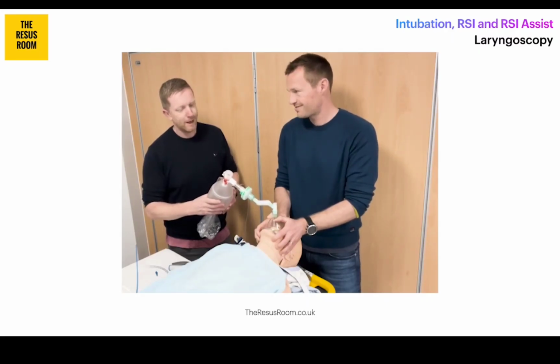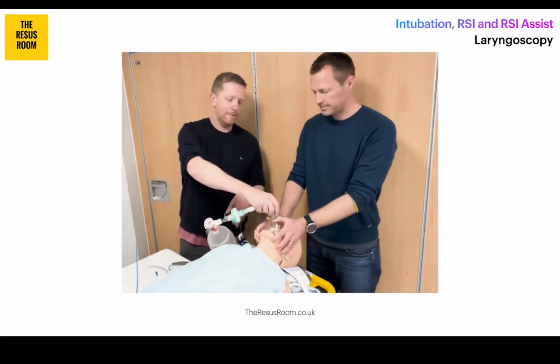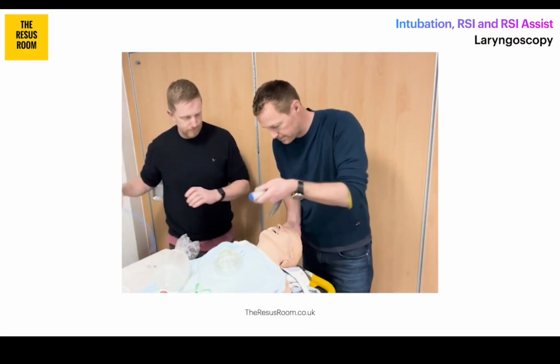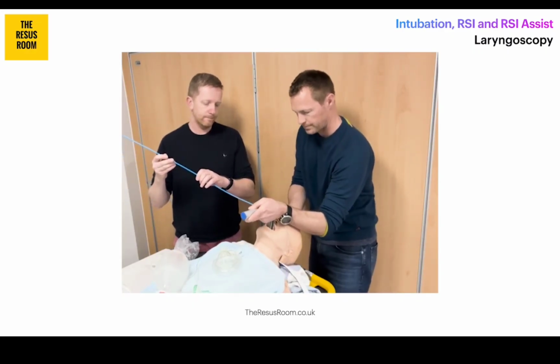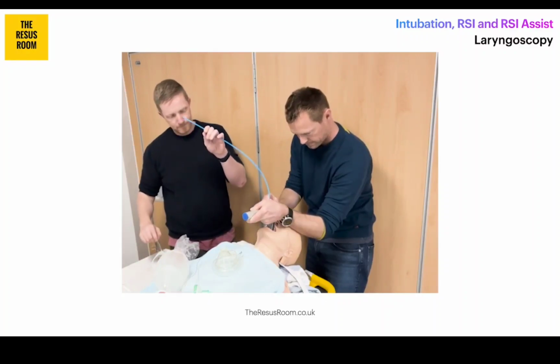Okay, so we're to the point now that the patient's nicely relaxed, the jaw's nice and relaxed for up to 60 seconds at least. I've actually got the reassurance that we can ventilate, which is great. They look very relieved. Okay, the blade comes from operator 2 over to operator number 1. Goes in the right side of the mouth, sweeps the tongue out the way, epiglottoscopy, finding the epiglottis, revealing the larynx. Across comes the bougie.